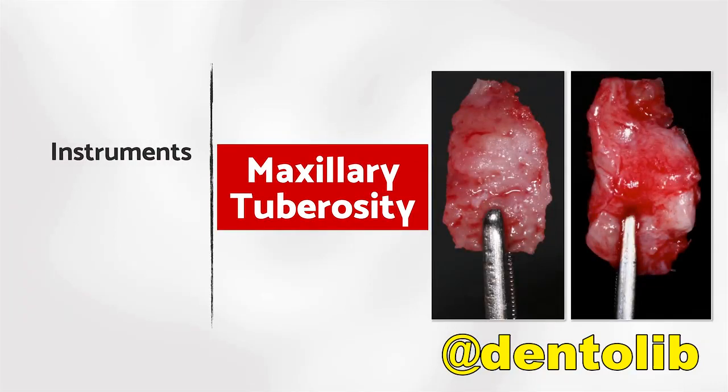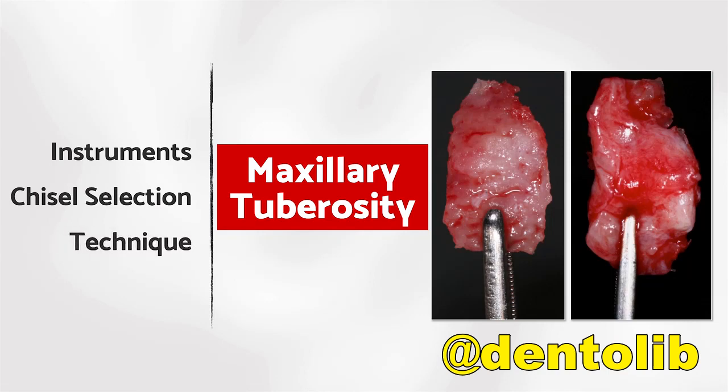I'm going to talk to you about the instruments that we need to apply this technique, the chisel selection, how to select the right instrument to take bone from that donor area, and the technique itself. Many different ways to take bone from the maxillary tuberosity.